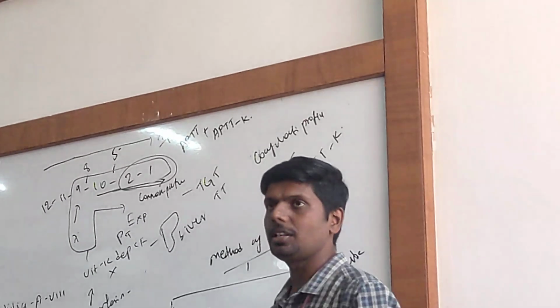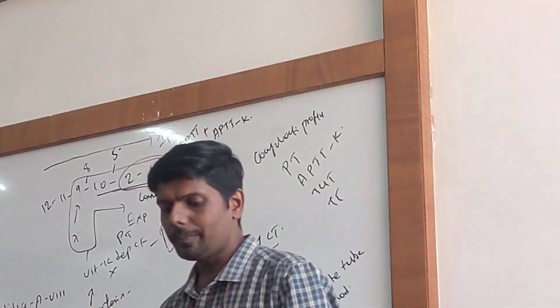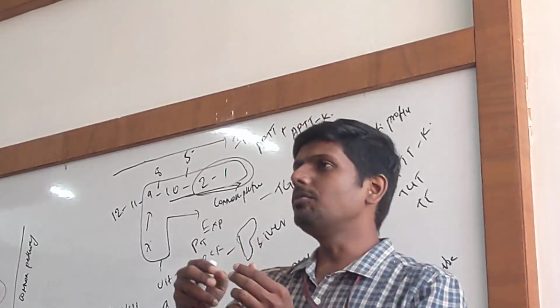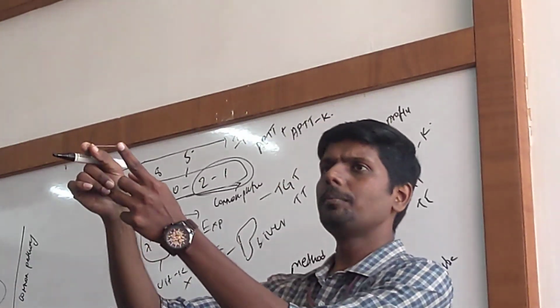Then you will get your fibrin thread. That is the clotting time test. Now, there is a challenge. There are some problems with this test. The problem was, now the blood was outside the body. Am I correct? Blood was in this tube.